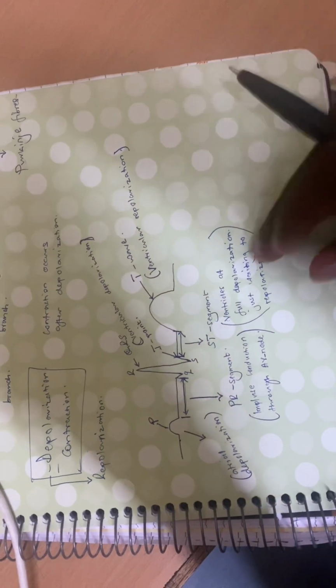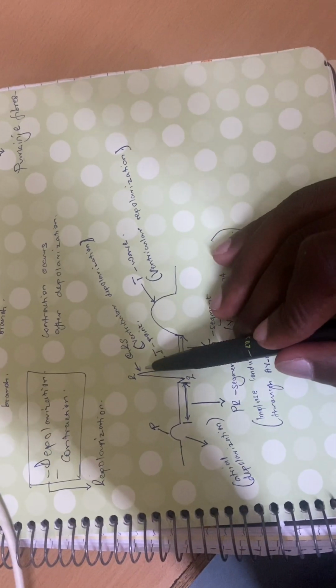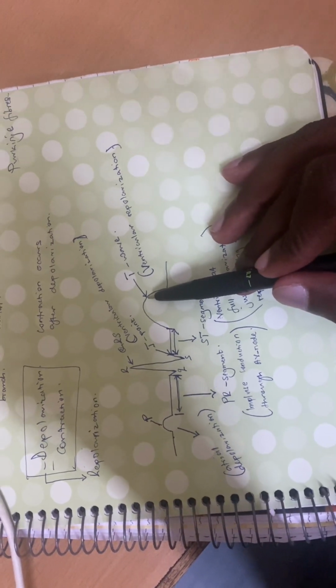Yes, that is the full interpretation of our ECG as this is how we can connect the ECG to cardiac electroactivity. So we are seeing on ECG atrial depolarization, ventricular depolarization, and ventricular repolarization. Those are the three things we are seeing on the ECG.